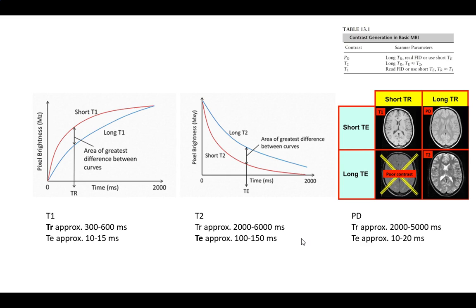For a typical material, if you set this right about 2/3, about 67% of the way up, you'll hit most of the materials. At that zone, you're pretty darn close to the whole 1/E. Hence why they say, roughly speaking, set TR equal to your T1, because that'll get you to 1/E, which is pretty darn close to the maximum peak. So that's the whole reason this came in.